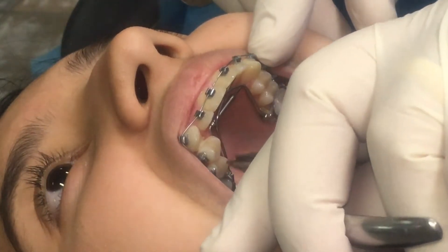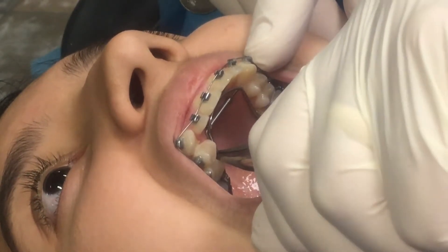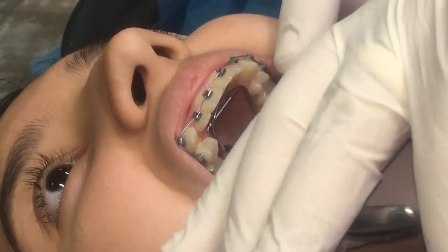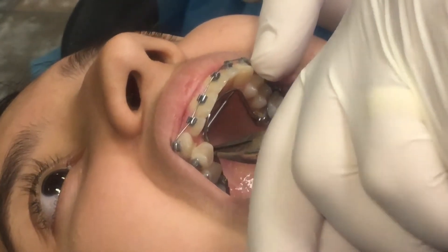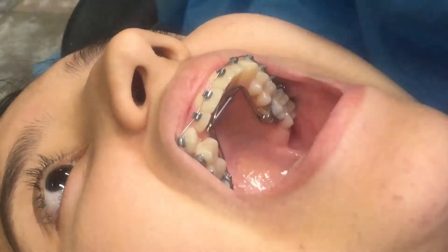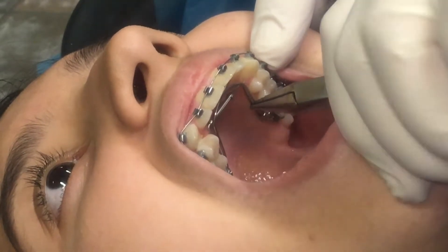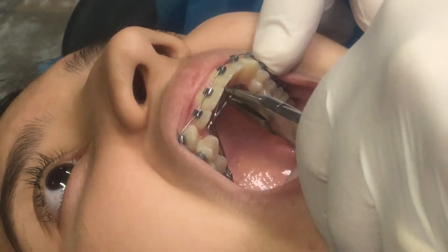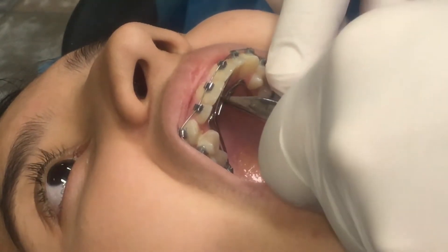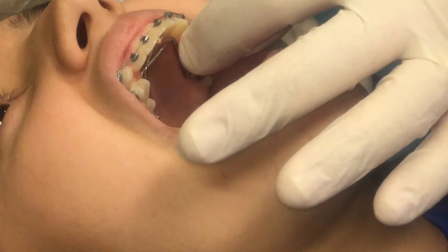But today I'm going to activate it a little bit. What we do is get in here and give this a squeeze — it kind of bends that wire a little bit and gives it a little extra push besides just the cylinder of the transforce that's pushing as well. I'm going to do a little adjustment so it'll push on those front teeth also. I went ahead and tightened this up and you can see it's kind of pushing up against the teeth a little bit tighter.